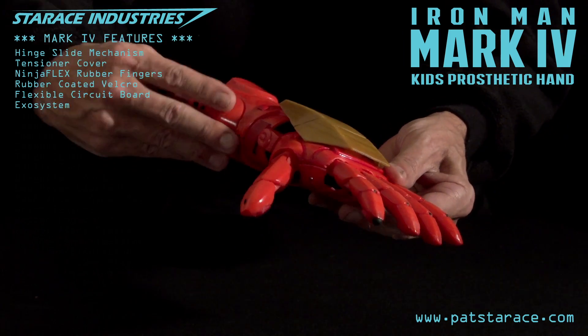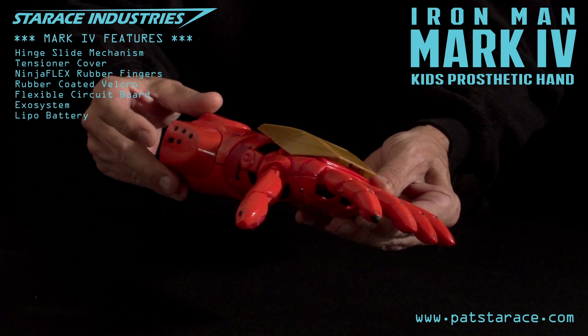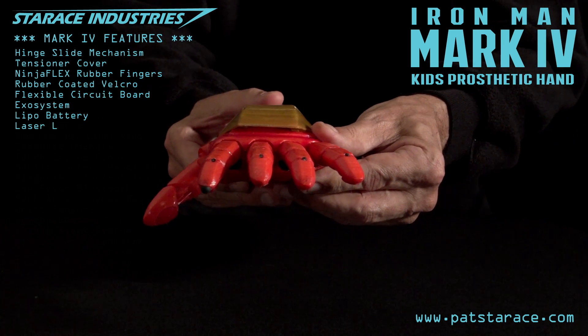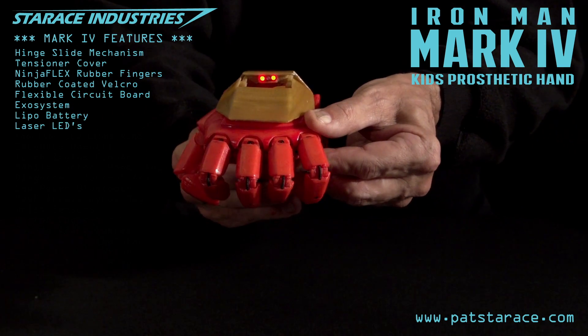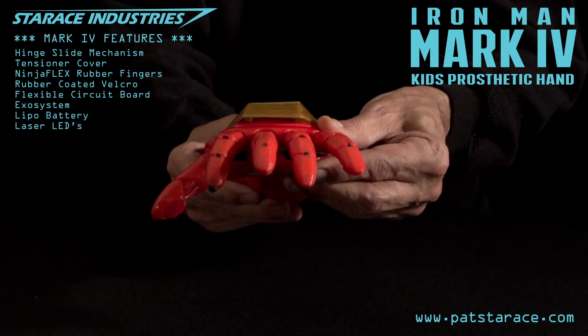Power source. The rechargeable LiPo battery is online at 100% capacity. Power on. Laser test — lasers are online and functional. Bend the hand down to activate. Fire lasers. Lasers off.